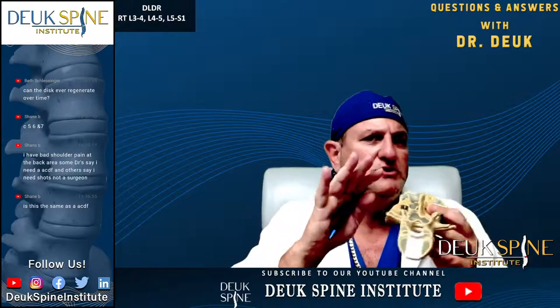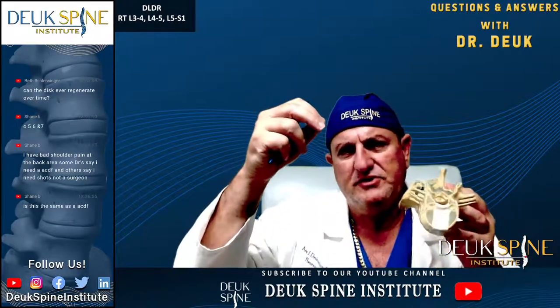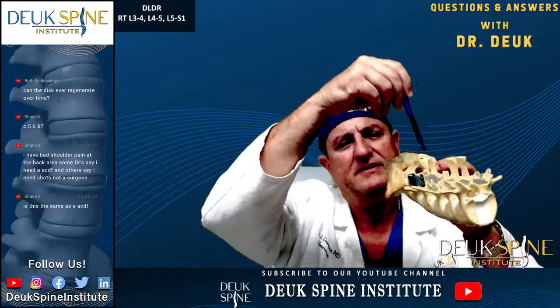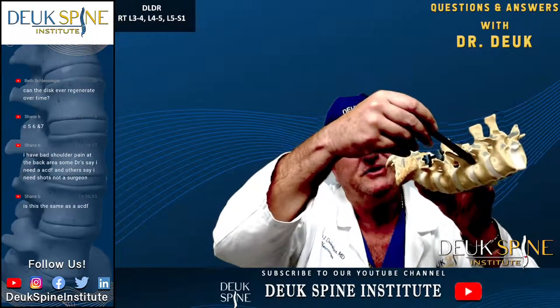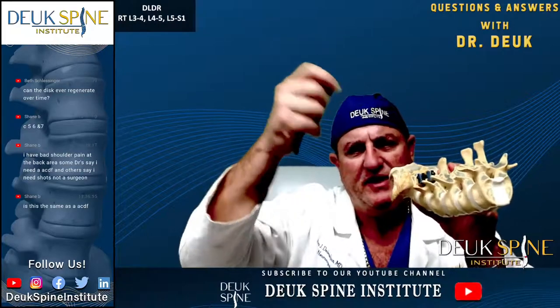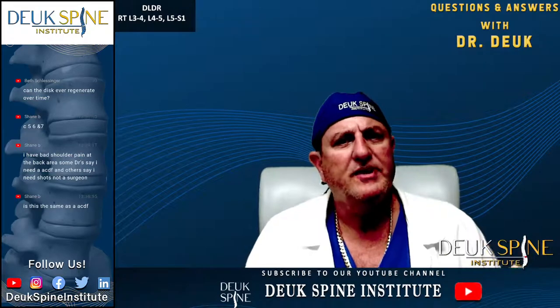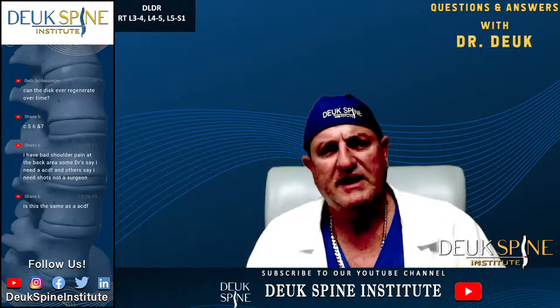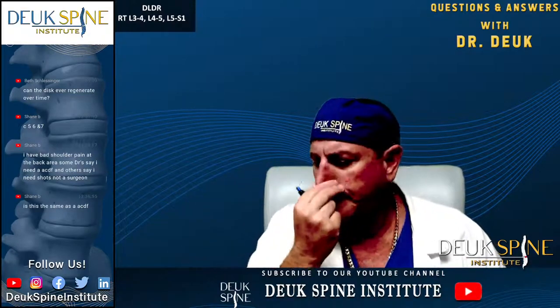Now remember, I want you all to understand something. The beginning of the surgery, I put a needle in. That needle went in, this is the back of the spine. That needle went in through this hole right here, right into the herniation, okay? This part of the surgery, putting the needle, the guide wire, and then the dilator, I did not create that. I learned it from surgeons before me, okay? Like Dr. Anthony Young, also the Koreans and a German surgeon, they taught me that.